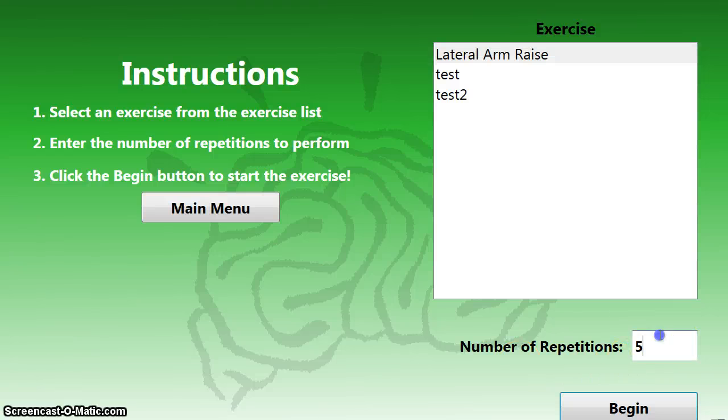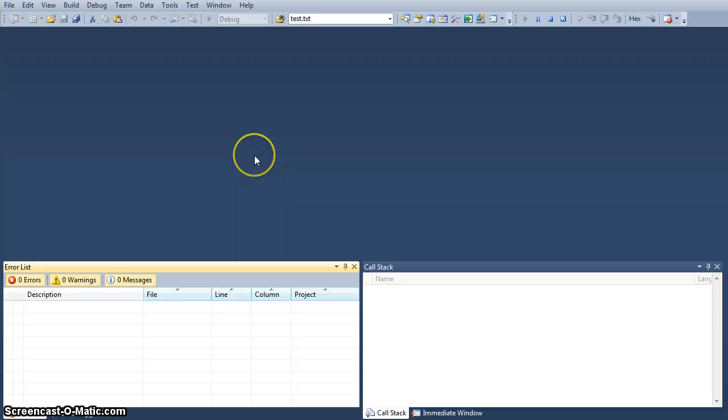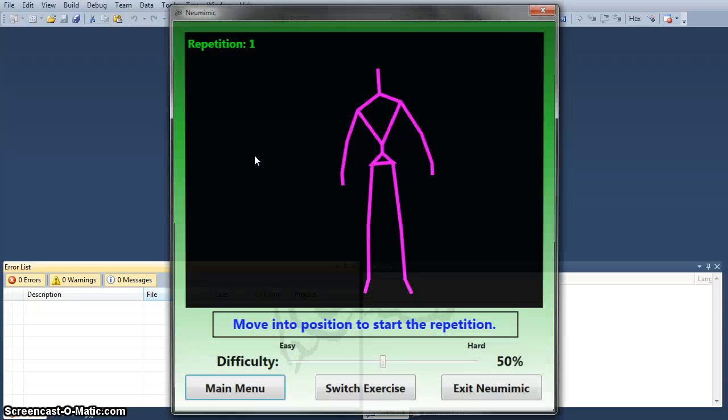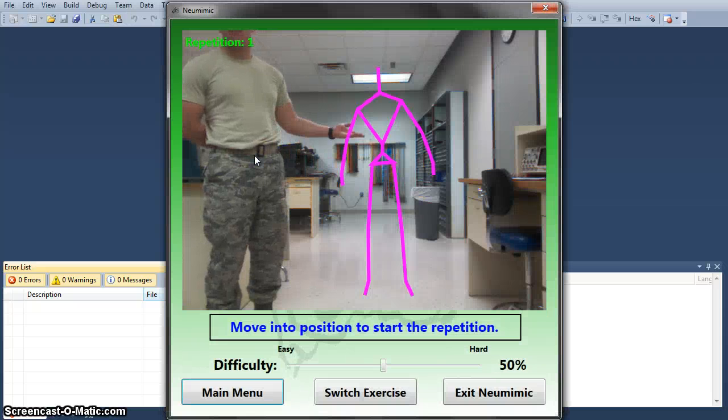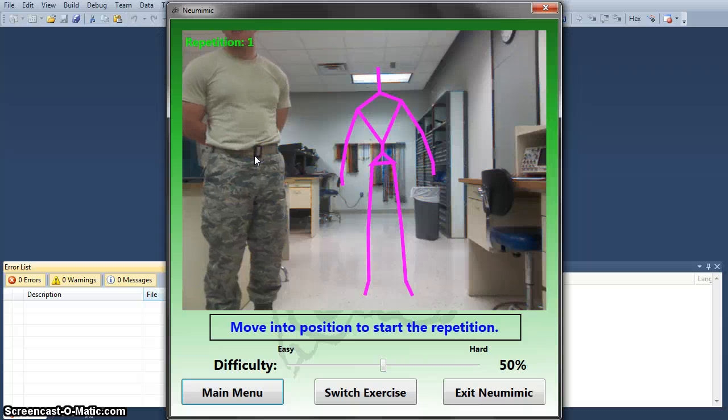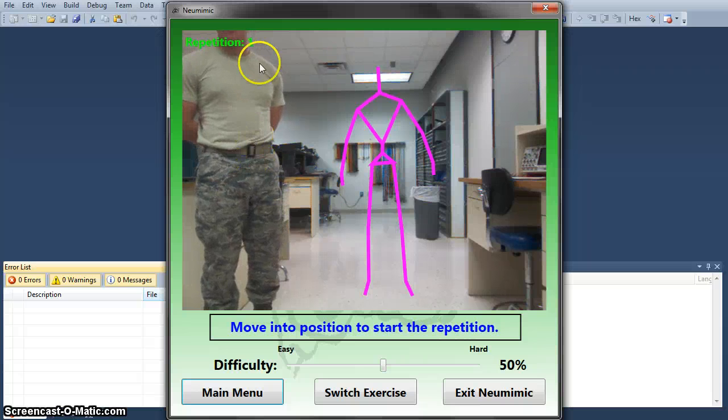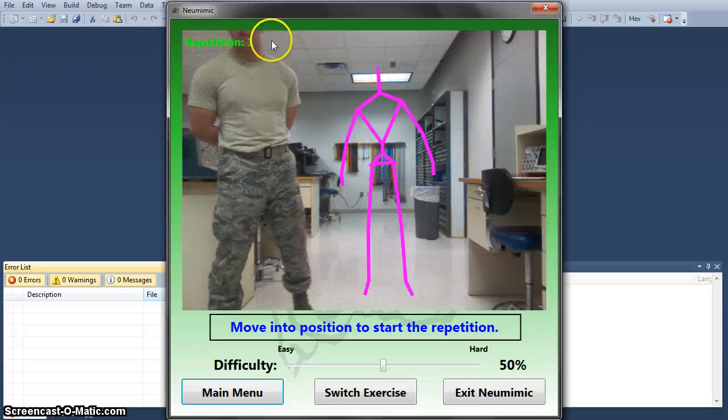Select Lateral Arm Raise. Go to Repetition 7 for demonstration purposes. You're about to see a purple skeleton show up on the screen. This is the skeleton that I must follow. I am currently not in position, so the repetitions will not begin until I get into position.